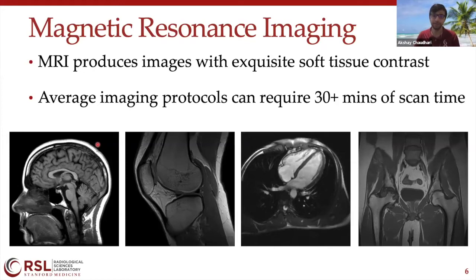And in addition to this, the total costs that are required to buy an MRI scanner, site the scanner, and to maintain it, those add up over time too. And this is probably one of the biggest reasons why the costs and the reimbursements for MRI have traditionally been quite high. But then we might question, why do imaging protocols require so much scan time?